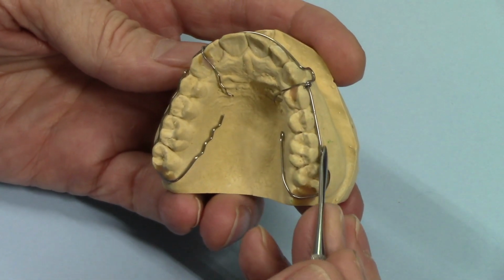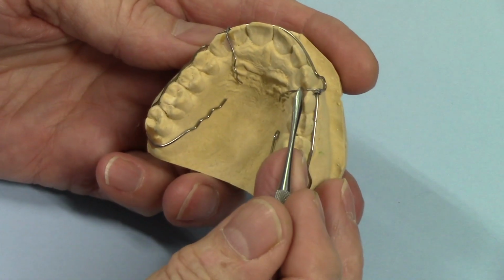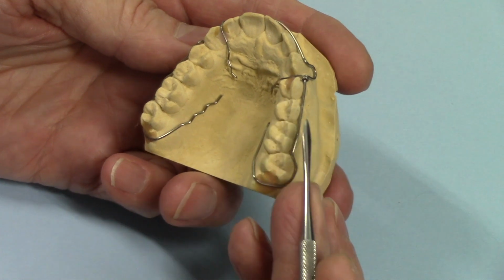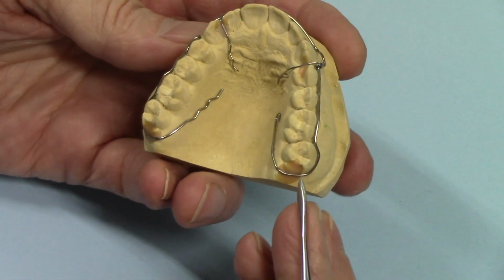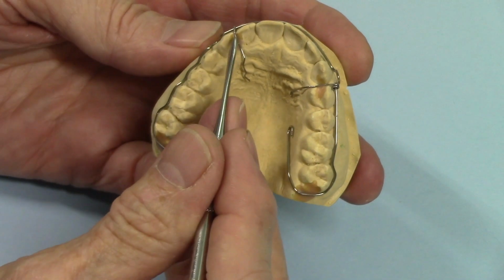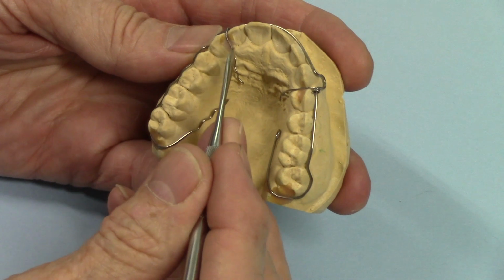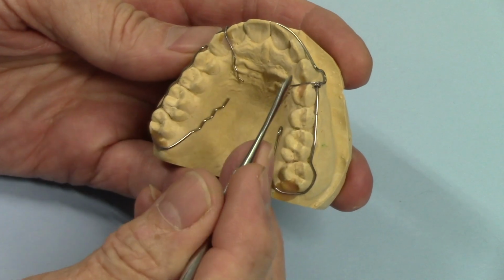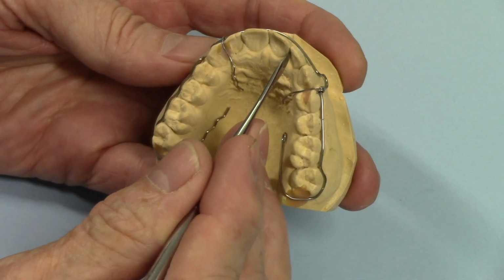Now this is an 030 retainer wire that wraps all the way around, and it has auxiliary support wires. If it didn't have these wires, this wire would be real floppy because it's only an 030 retainer wire. Now the auxiliary support wires are usually thin, and they'll usually go between the lateral and the cuspid, sometimes between the cuspid and the bicuspid. I've even seen them go between the centrals and the laterals.